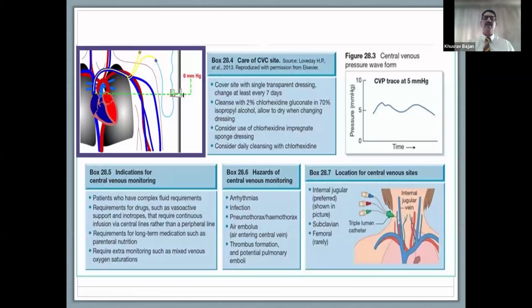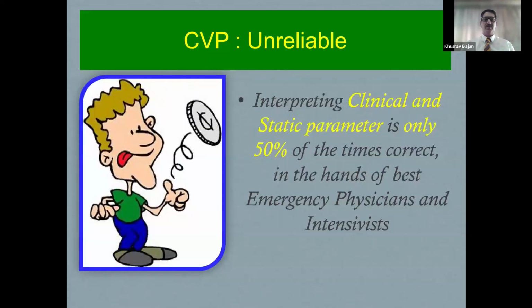But nowadays, we must always try to do ultrasound guided or focus guided central line and arterial line insertions, because in the best of hands, the earlier chances of pneumothorax were 1% with a jugular vein and 3% with subclavian. But with the advent of focus guided central line insertions, it should be near 0. So this is how we have evolved in our technology.